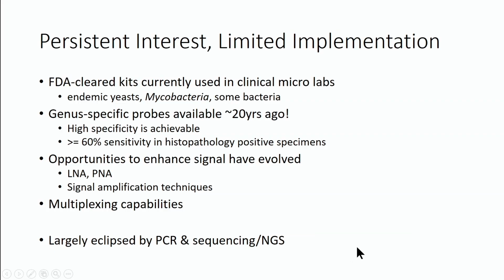And then I think the reason this hasn't taken hold in anatomic pathology labs is, one, you have to see enough fungal disease for this to really be useful. And two, it's just, I think, been eclipsed by the excitement around PCR, followed by sequencing, and now next generation sequencing.